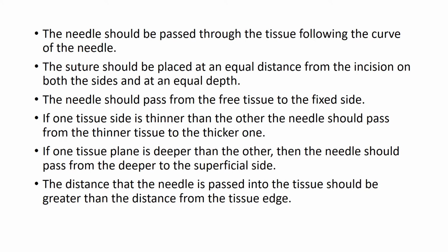Next, if one tissue plane is deeper than the other, then the needle should pass from the deeper to the superficial side. Deeper to superficial side. The other thing that needs to be considered is that the distance that the needle is passed into the tissue should be greater than the distance from the tissue edge.